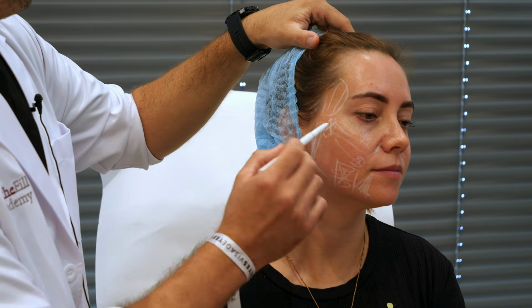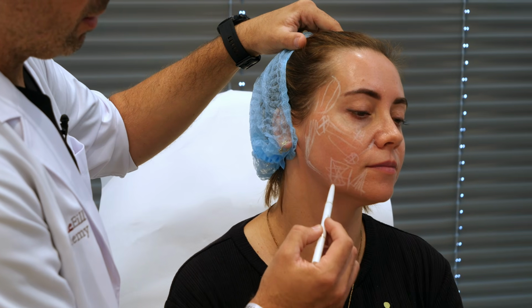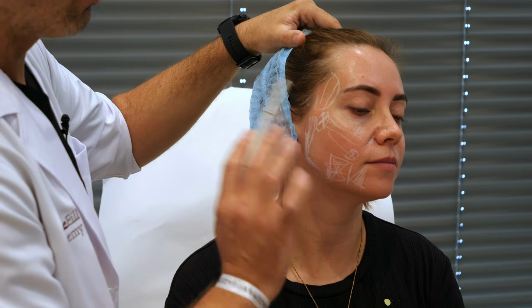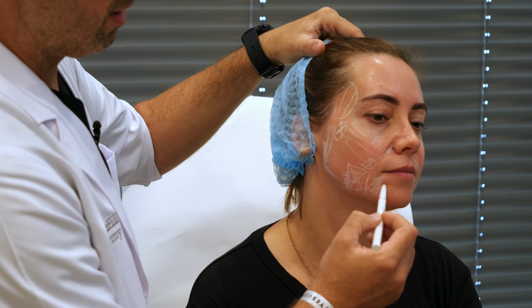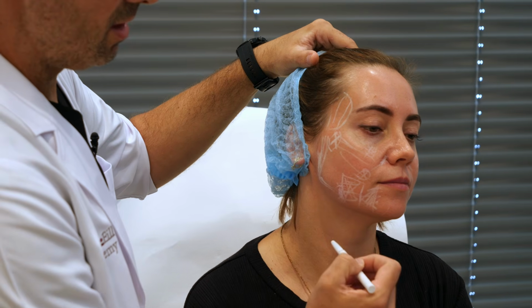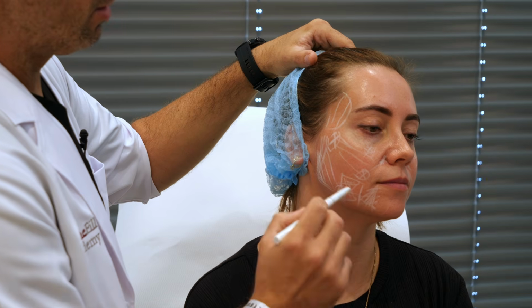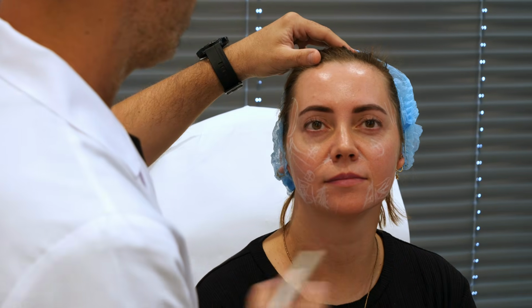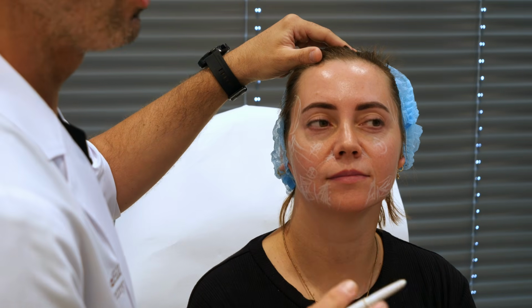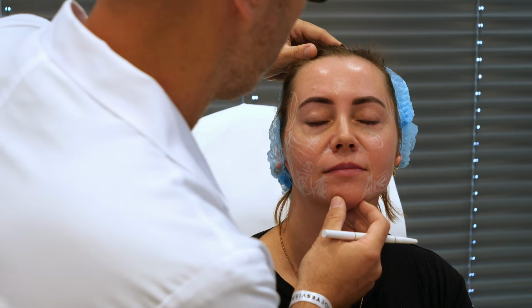And the other one depends if you want to treat from here with the cannula, only use the cannula to treat directly the chin and the jaw angle, okay? And the other side the same. This is a very symmetric face. Don't lose too much volume on the left, on the right, okay? Thank you, Maya.